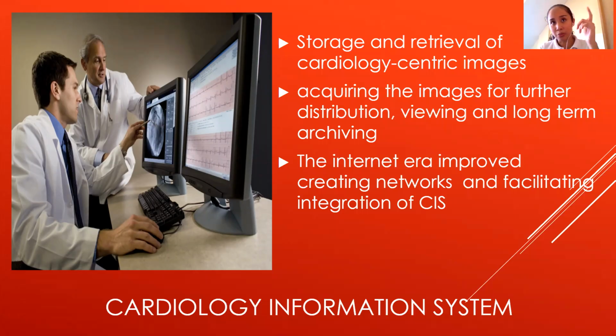They are the ones who store and retrieve cardiocentric images. In some hospitals which are really big, all the images that visualize the heart are separated from your radiology department or your radiology information system.